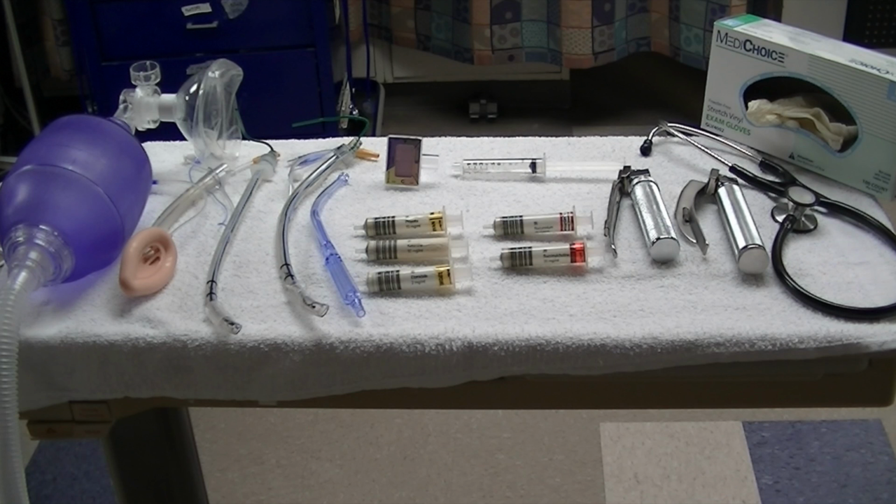A good mnemonic to remember when getting ready for intubation is SOAPME: suction, oxygenation, airway equipment, pharmacology, and your monitoring equipment. This is a pretty standard layout of your airway equipment. Using the mnemonic you just learned, let's start with our suction.